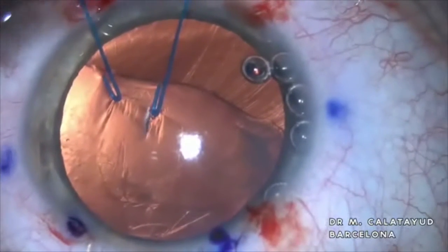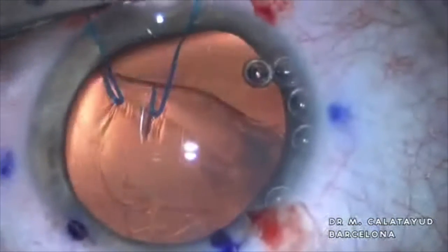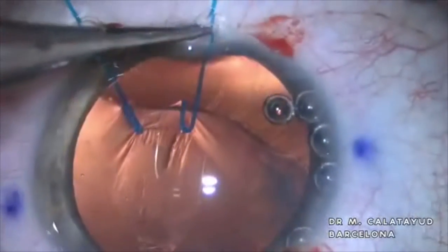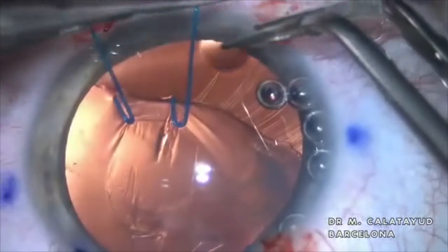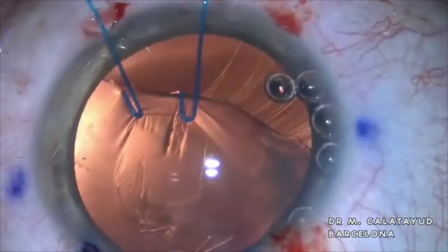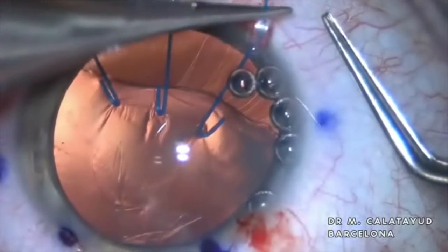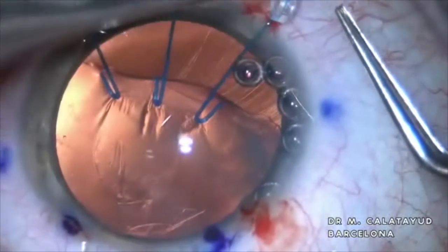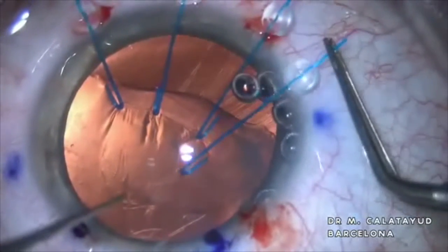It is recommended two iris hooks to cover 90 degrees of subluxation of the crystalline, so in this case we are using four iris hooks and we must be very careful not to tighten the silicone knot too much. These devices are not designed to hold the capsule because it could break if it is too stretched and complicate our surgery.